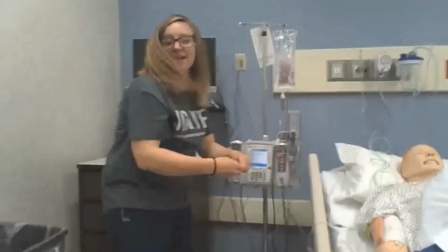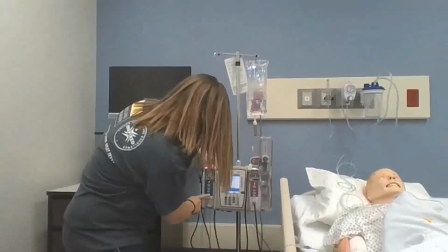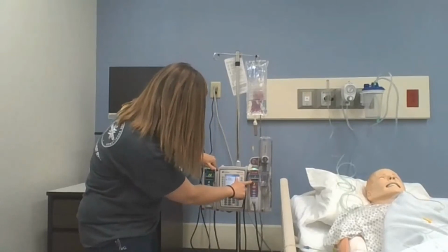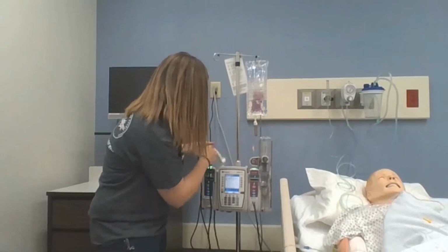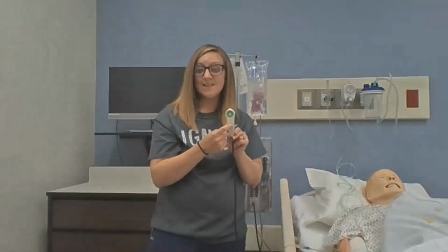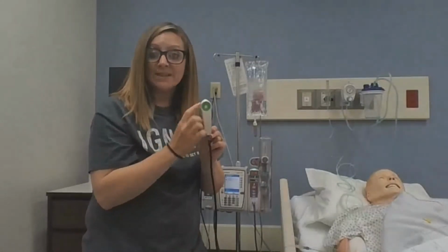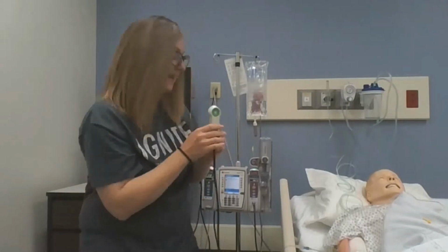Then I'm going to come here, make sure that my line is unclamped. And it's going to scroll across this marquee saying that they're getting the PCA plus continuous dose of hydromorphone. Okay, the green light is on, so everything's good. If you'll notice on our dose cord, this is the button that you're going to teach the patients about. It's got a bright green light in there, and so as long as that light is on, they can hit the button and it will administer the medication.